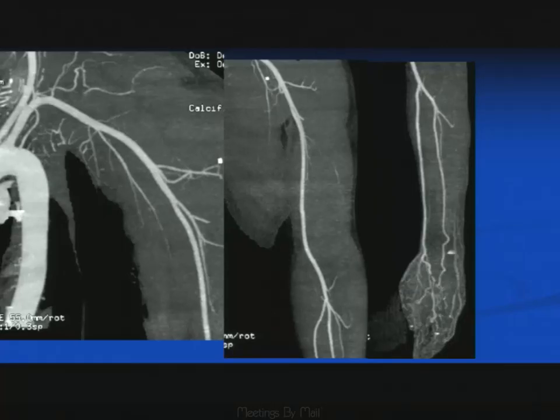Here's a circumstance where the arm is by the side. This is usually an ER patient situation. Again, they can't elevate the arm. This is not as good because obviously you're including the body as well as the extremity in the CT exposure. It affects the resolution of the scan to some degree and also obviously affects patient radiation dose.